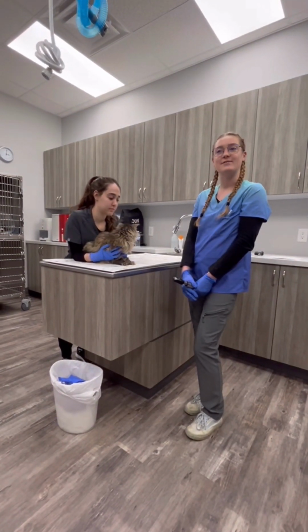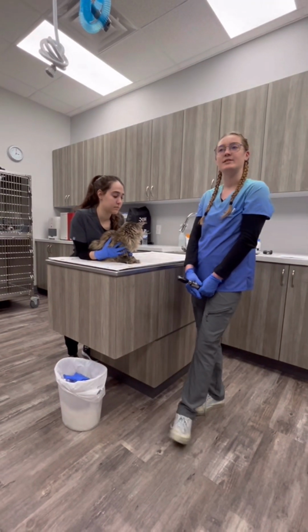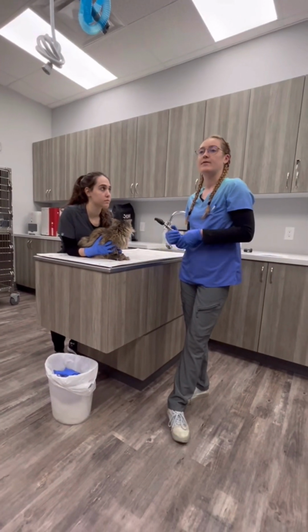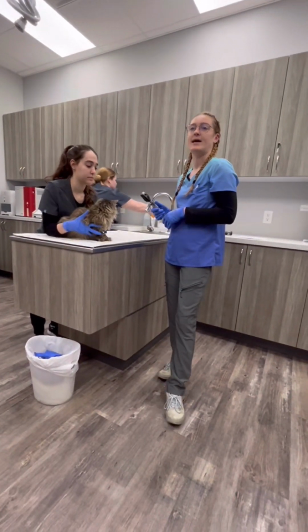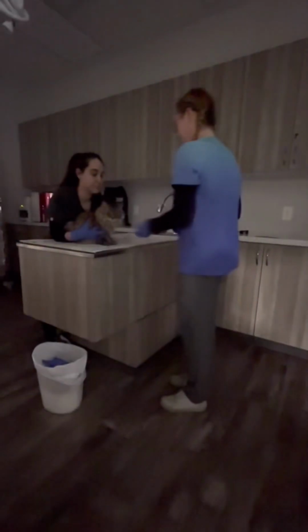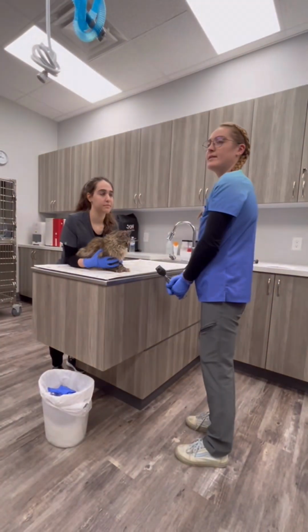I will now visualize the retina using the ophthalmoscope. I do not have permission from my clinical mentor to dilate the pupils, so I'm just going to be turning the light off in order to visualize the blood vessels, the optic disc, and the retina. There are no abnormal findings in the visualization.